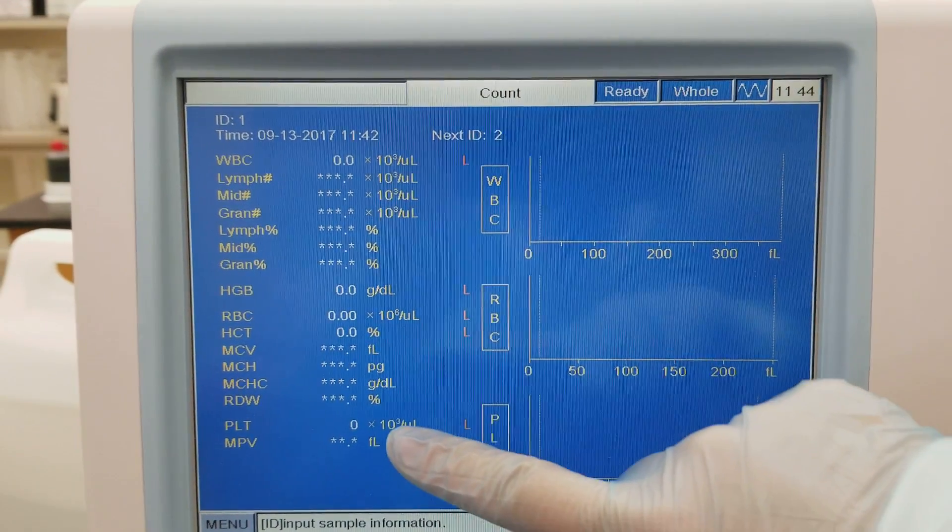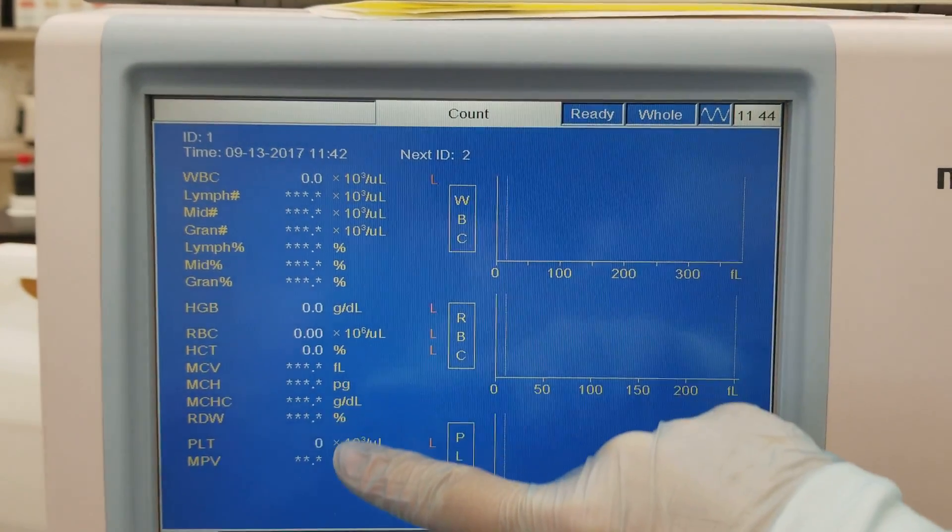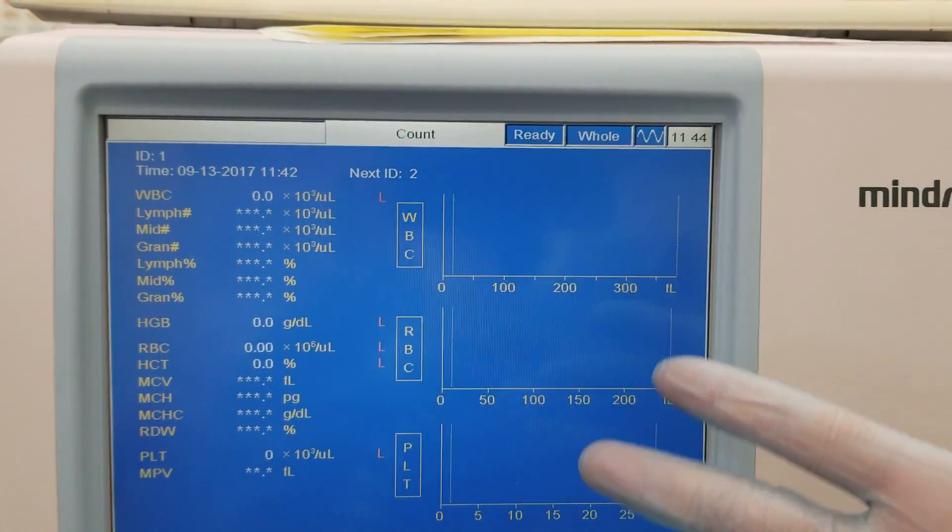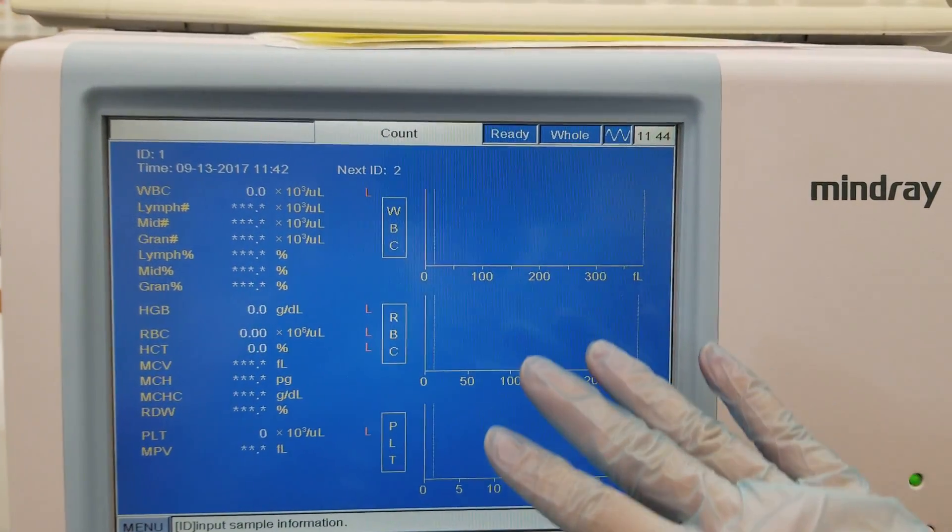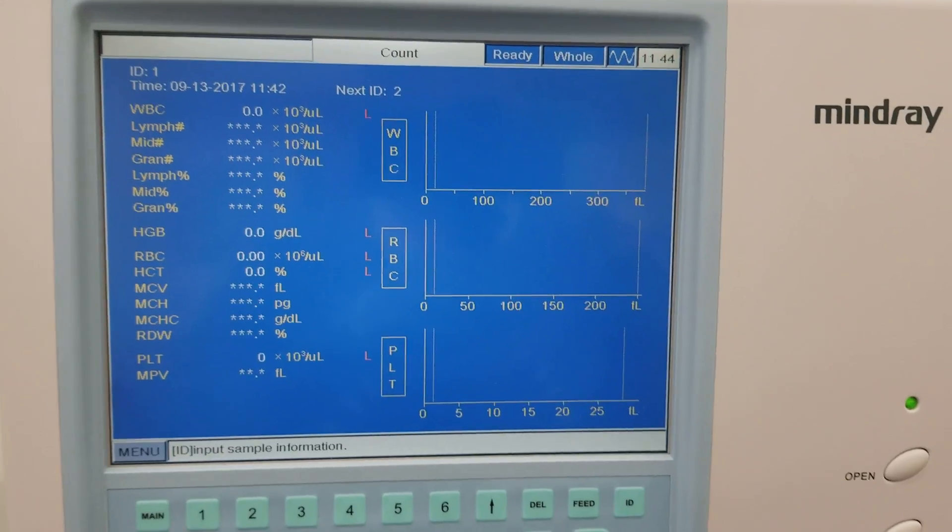It's working great because everything is zeroed here. The instrument does flag that as low, which is wonderful. There's nothing in the histogram windows, so that means everything is ready to go.